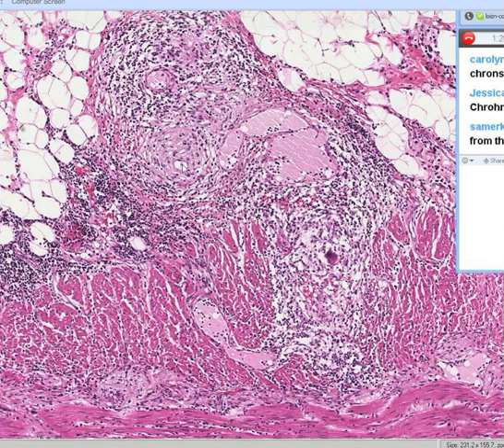And you would say, look, this is a little granuloma. So we said whenever you see granulomas as part of an inflammatory infiltrate in the bowel, you know it's Crohn's colitis, because another name for Crohn's colitis is granulomatous colitis.